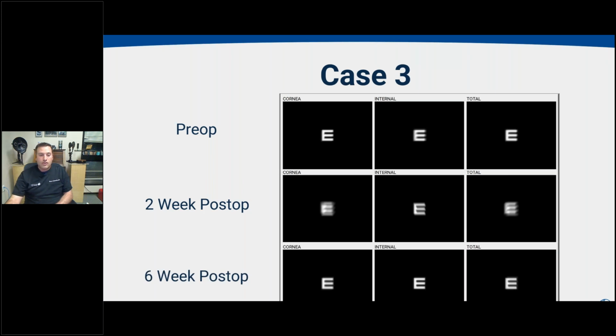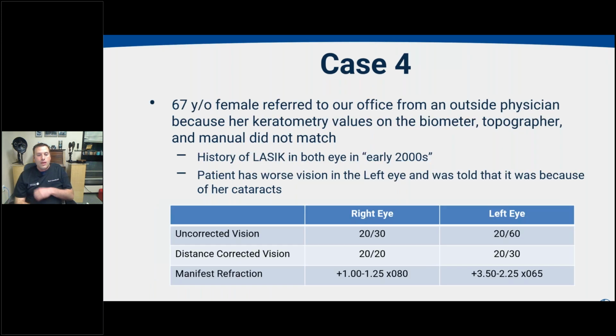She is obviously telling you already that her vision is better, but you're seeing it and you can show them their progress with the visual performance display. You can show them, look how much better your cornea has now gotten. This is why your vision is getting better. And as long as we keep you on this preservative-free regimen and eventually off, hopefully, topical therapy entirely, our anticipation is that you are going to do equally as well with your right lens as you are doing with your left.